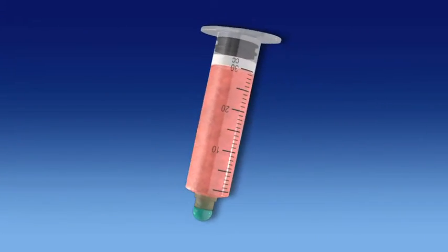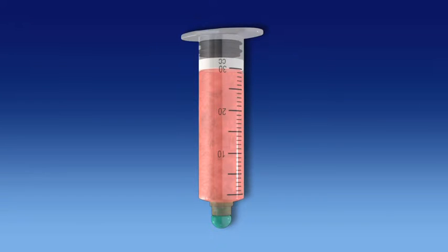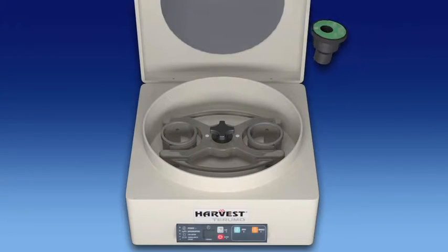Adiprep technology is based on a proprietary floating lipid barrier disk built into the processing disposable, which efficiently separates oils and lipids from adipose tissue within the lipoaspirate sample after processing on the Harvest SmartPrep system.